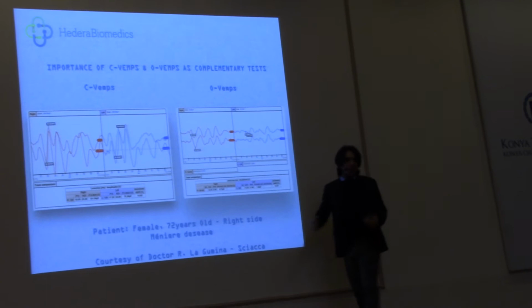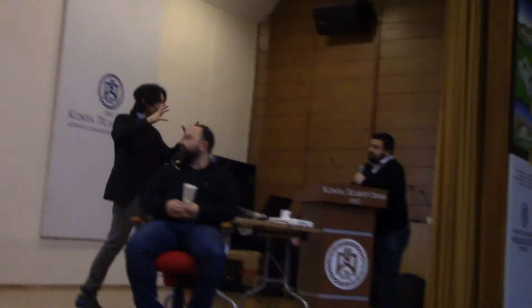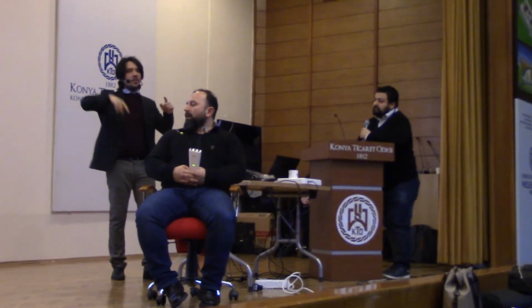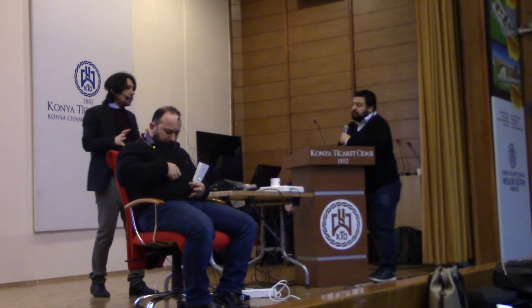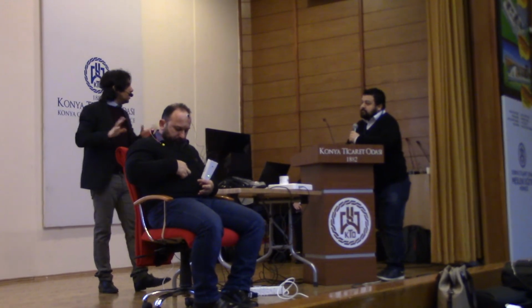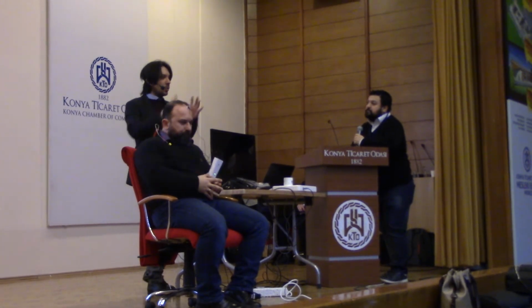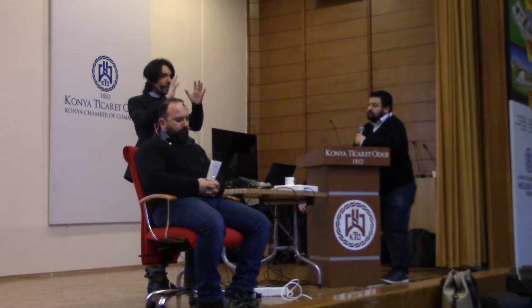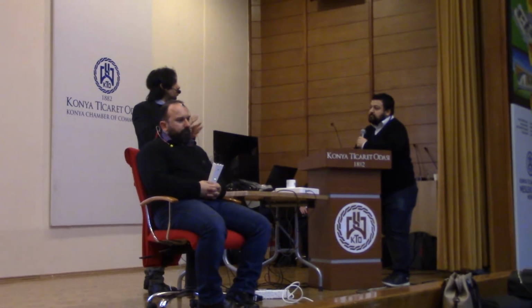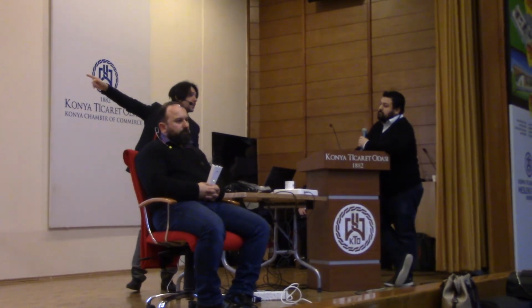You consider that an ocular VEMP as the typical first peak that is the one that we focus on, and then some bigger ones that are also repeatable, but actually, as I know, nobody knows what is the meaning for the other peaks, the following peaks. What we focus on and we are sure about its meaning is the first N10 negative peak. And in this case, we have only one side.